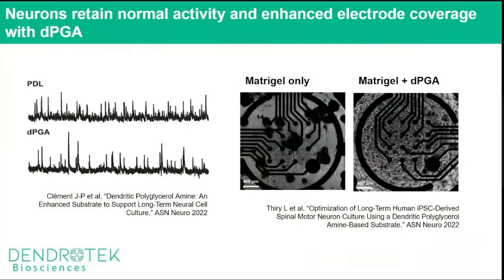Now, on the left, you can see some electrodes aren't covered. There's a lot of clumps. And on the right, you can see a more stable monolayer of cells, and all of the electrodes are covered, and all of the electrodes are active in that work. So we think MEA users are going to see a lot of benefit from testing out dPGA.